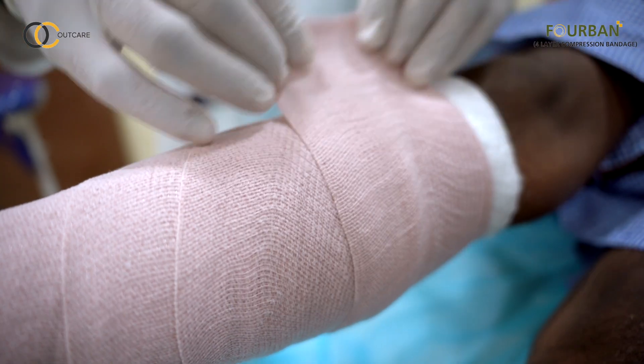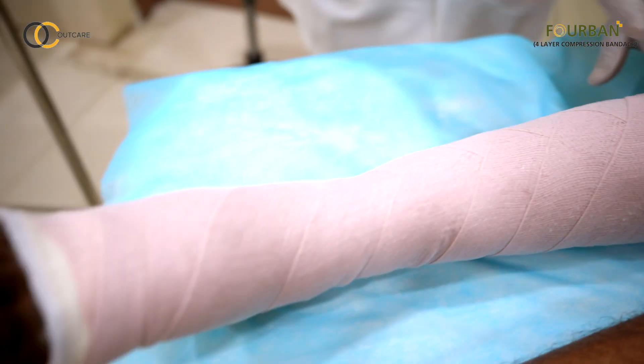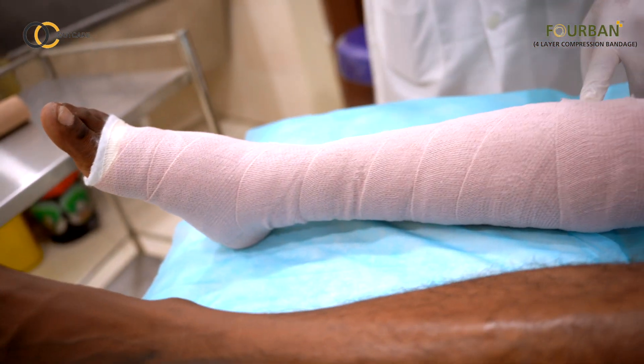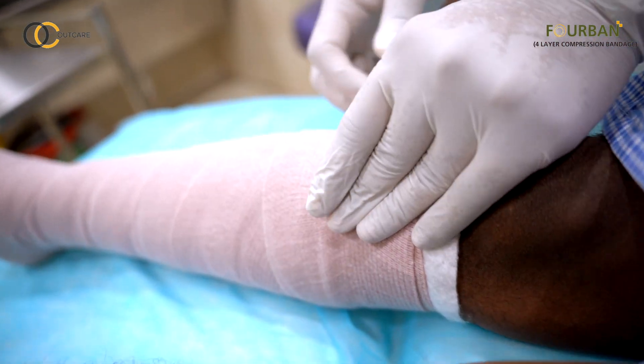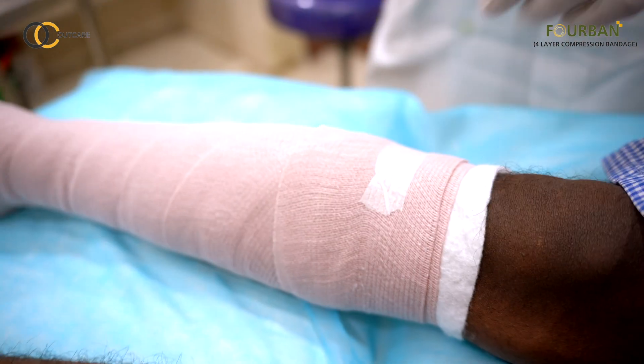At the end of the procedure, it should look like this. Secure it with a paper plaster.